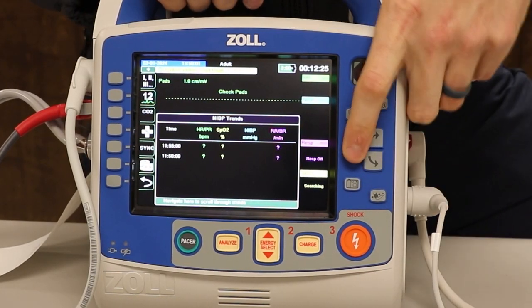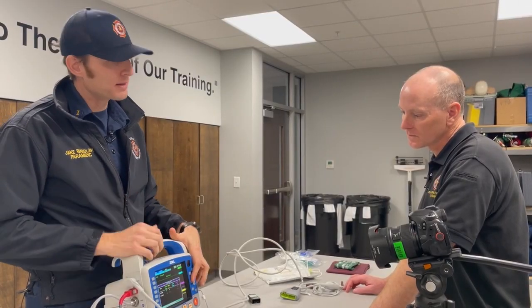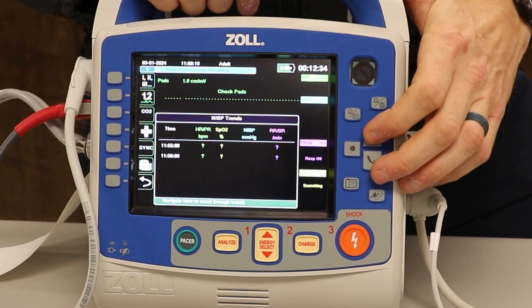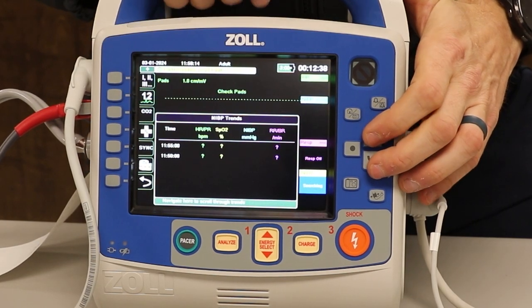The circles are selectors, so wherever we navigate on the screen, if we hit that circle, that's how we actually select the option that we want to manipulate. Okay. This is our up and our down all over the screen. So if you see that blue is moving all over that screen, that's your selector. Perfect. So that's how you manipulate the actual screen of this monitor.